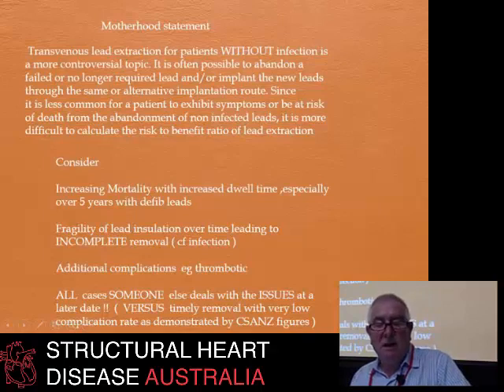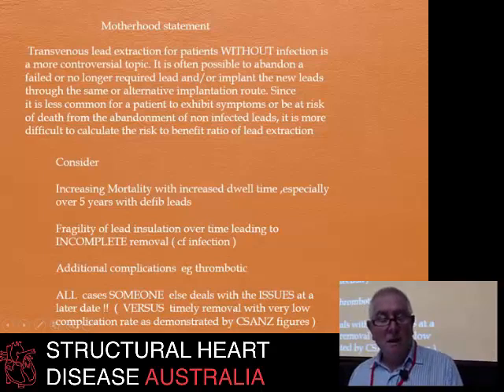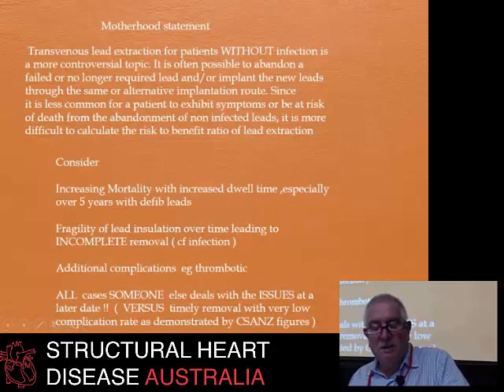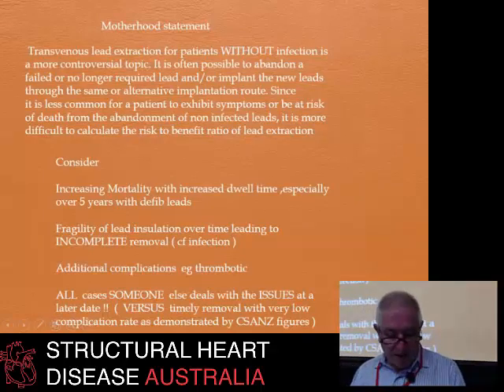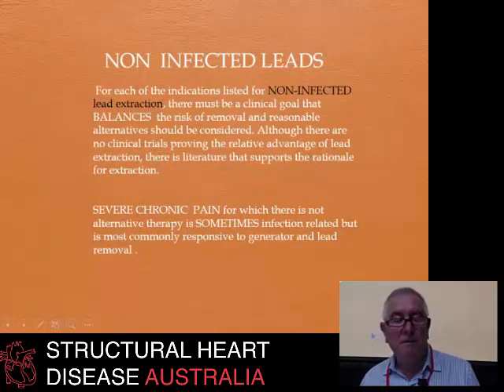The insulation around the outside of the lead sometimes starts to deteriorate, and that leads to incomplete removal. And then you have the possibility of additional complications such as thrombotic phenomena in the vein. So essentially, I think what this statement says is, I'm going to leave it to somebody else to deal with. And I don't know that that's an appropriate way we should be dealing with it, particularly when we look at the low complication rate that we see in Australia.